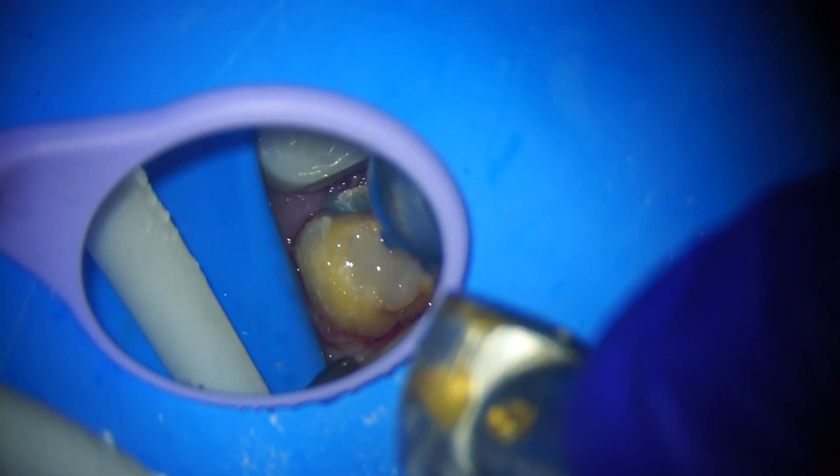Then we can do tooth prep under the microscope — that is why I made this video. From the start, RCT till crown, you can do beautiful preparation under the microscope.